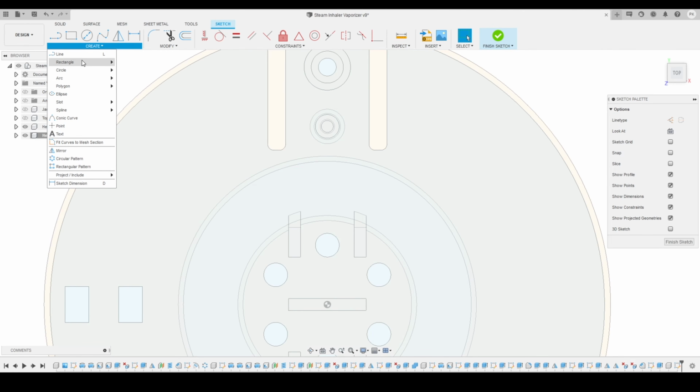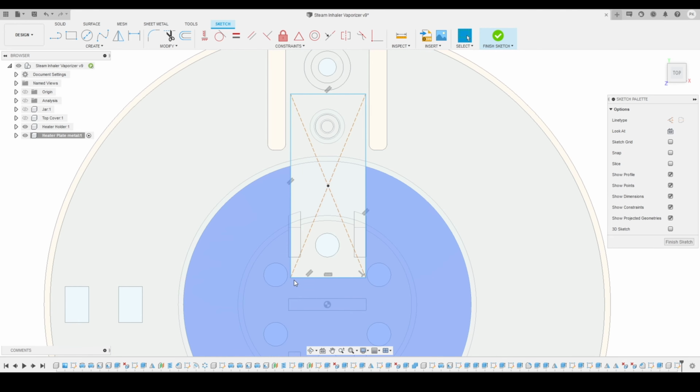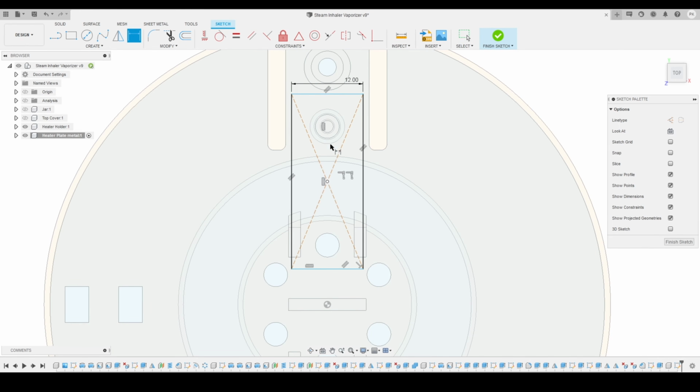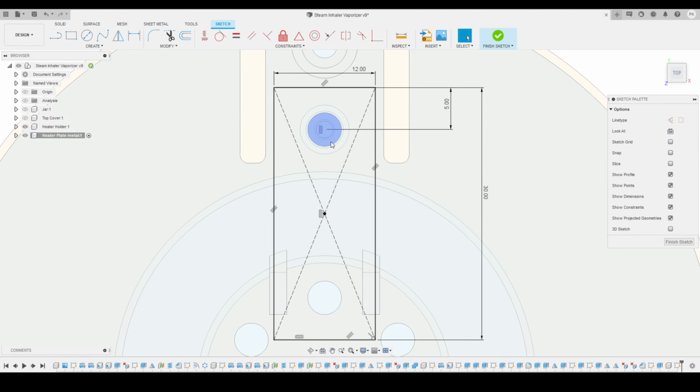So I will first go to the create panel over here, then we'll activate the rectangle tool, and I will create a rectangle like this. Now I will define the size of this rectangle and also the position of this rectangle with respect to origin. So this side I just want to keep 12 millimeter, and from this center to this center I just want to make them on the same position, collinear, these two centers. And also I want to define the distance from this center to the heater plate, the side of this rectangle is 5, and I also want to define the total width of this rectangle as 35 millimeter. Here you can see it's a little higher, so I will bring it a little lower, so maybe 30 will work.